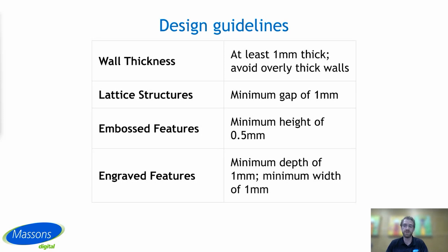For any embossed features, they must be designed using a minimum height to ensure visibility and to prevent the detail from wearing off during post-processing. We recommend a minimum height of 0.5 millimeters.